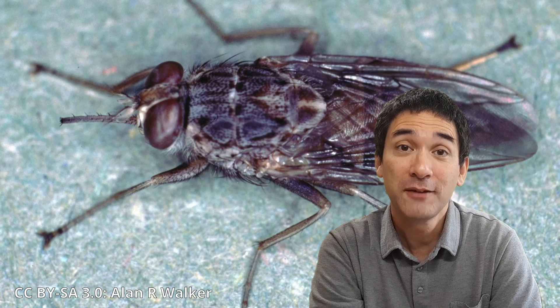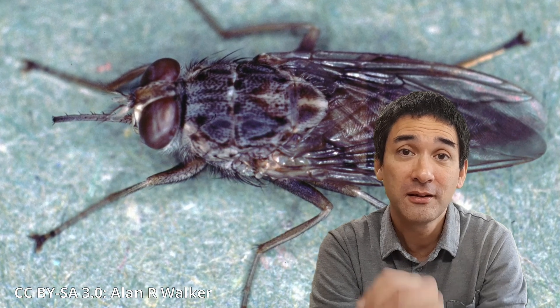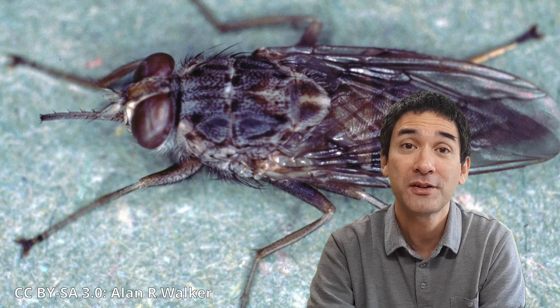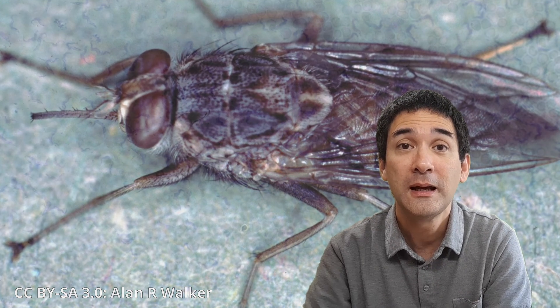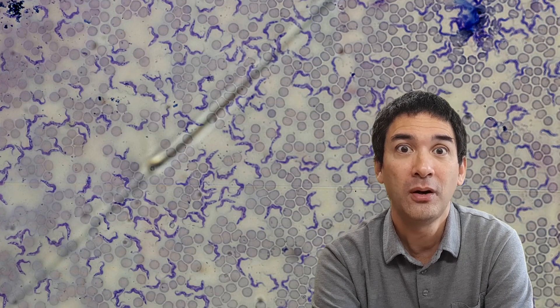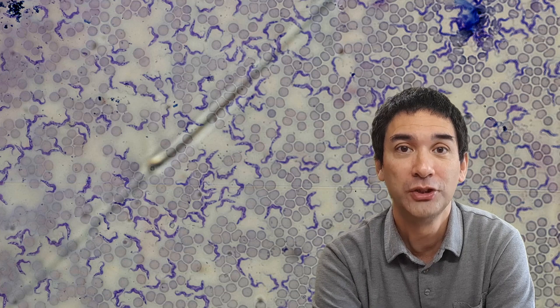Here is a picture of the tsetse fly, which bites a person and is able to transfer the parasite from person to person. After a couple of weeks the symptoms start. If you just look at the specimen under the microscope, the number of those trypanosomas is really high.